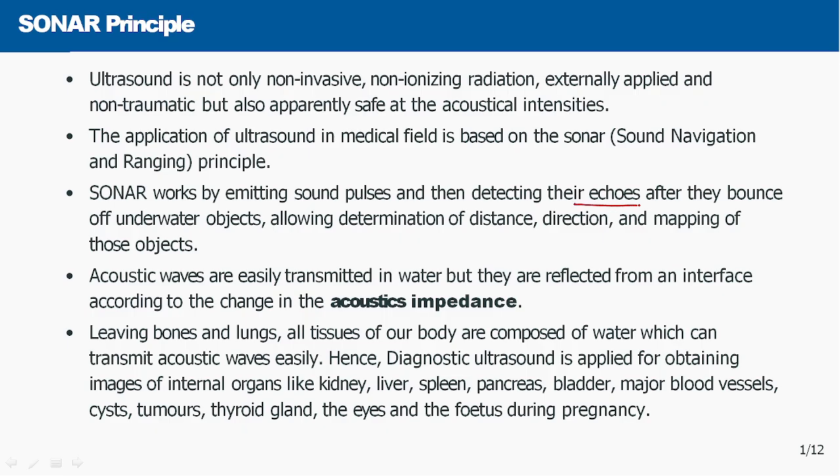We call them echoes. They bounce off underwater objects; normally this sonar technology is used in water or a fluid medium. They allow the determination of distance, direction and mapping of objects underwater.